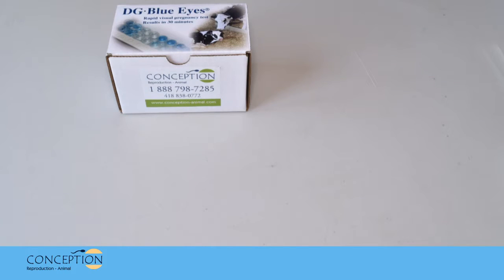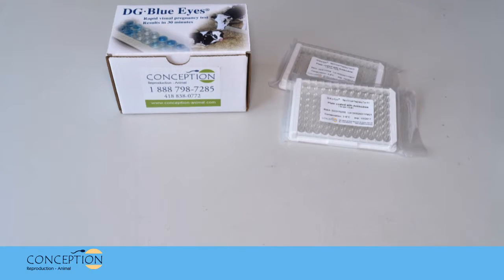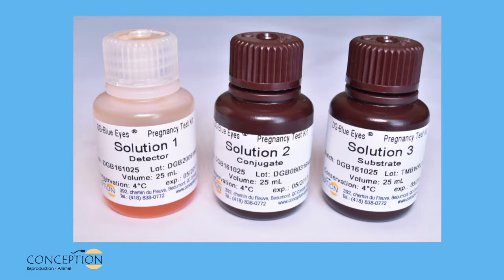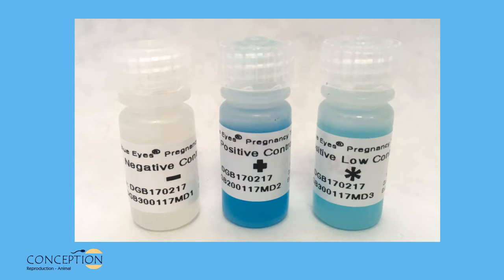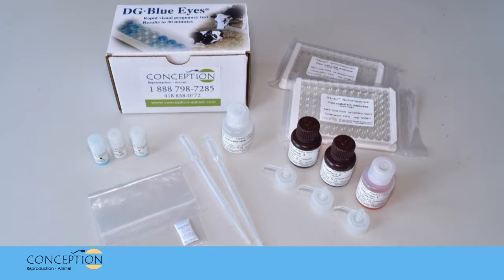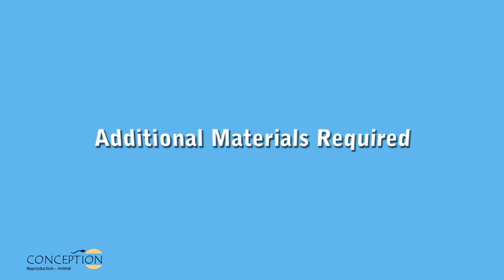The DG Blue Eyes kit includes two 96-well modular plates, solutions 1, 2, and 3. Solution 1: detector. Solution 2: conjugate. Solution 3: substrate. Quality controls: negative control, positive control, and positive low control. A concentrated washing solution 100X, 3 drop dispenser caps, 1 sealed plastic bag with desiccant, and 2 transfer pipettes. Additional materials required are available from Conception.